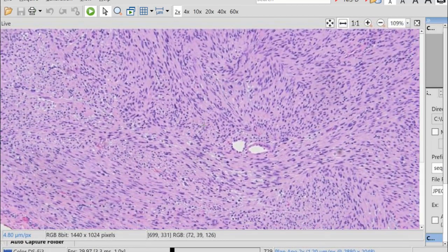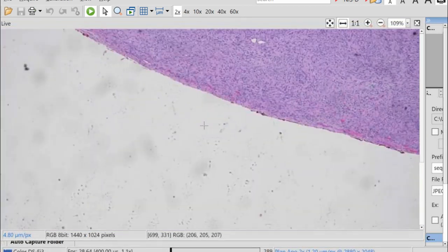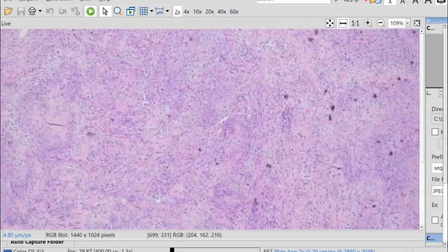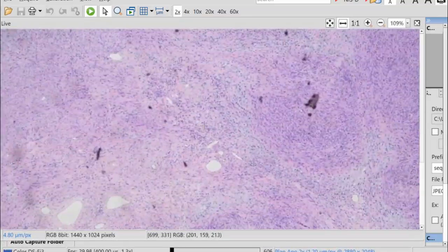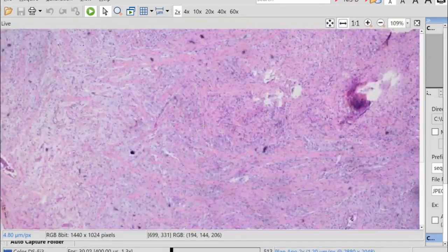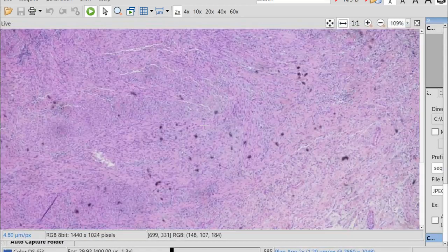And from it, you also had that other lesion that was actually more infiltrative. So that made the surgeon think that probably was not really a part of the schwannoma. We saw this in frozen section and we called, this looks like a real schwannoma, but there was that other component that, to us, we were more favoring neurofibroma.